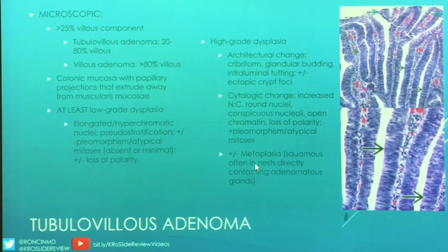As in all high-grade dysplasia, you start seeing an increased nuclear cytoplasmic ratio. The nuclei have stopped becoming elongated and start rounding out. So you get these really plump, really bizarre looking nuclei. The chromatin can still be relatively open. And again, you're going to have that loss of polarity. If you do have mitotic figures, do expect to see some atypical mitotic figures. So whether it's a snowflake or a smiley face or something, it just doesn't look like anything that should be in any of your textbooks unless that textbook is showing you atypical mitotic figures.